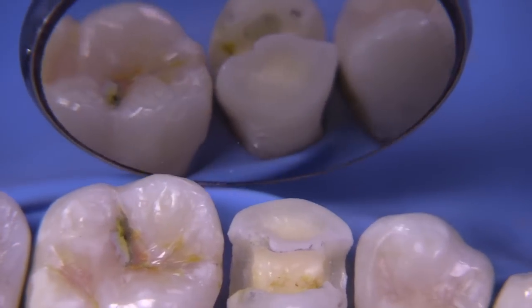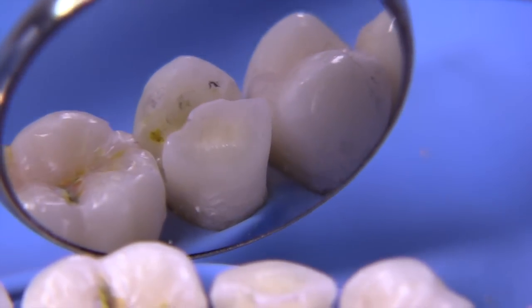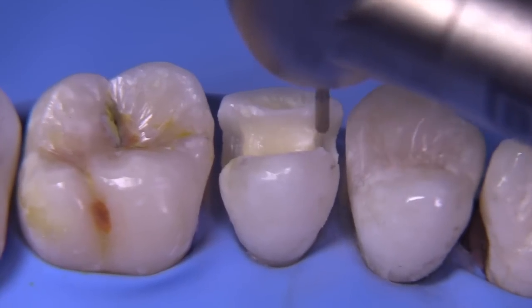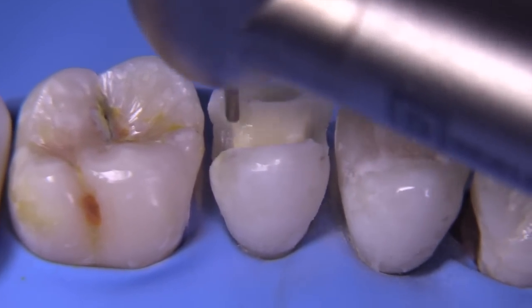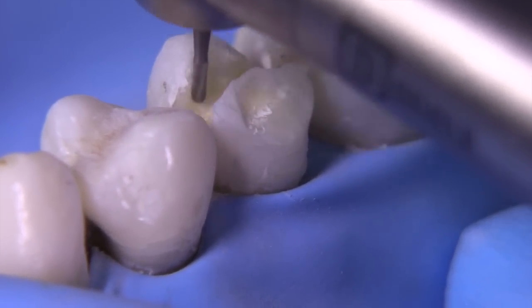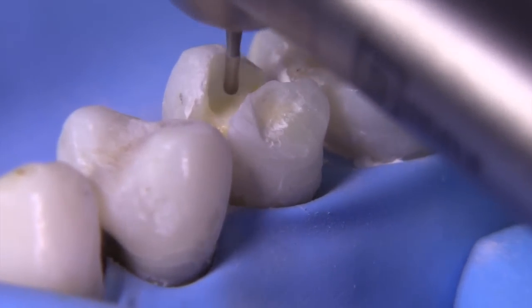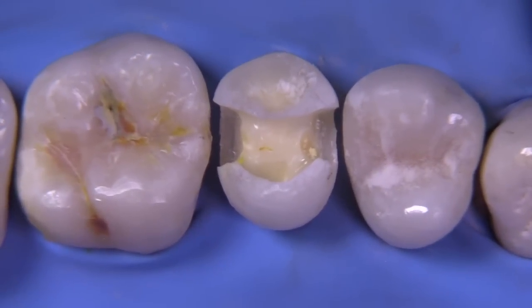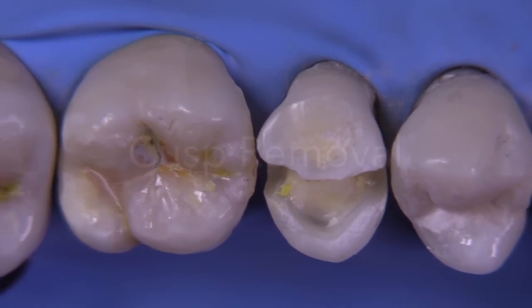Once all of that decay is removed from underneath that cusp, we now need to expand the outline and remove the cusp. I'm going to utilize the 245 carbide because it's longer than the 330 and those cusp walls are pretty tall. We're going to make sure we have a nice clean, rounded internal form and that the DEJ is squeaky clean. We extend the outline form wider and wider until we know that the enamel is resting on dentin. The outline form is going to get quite wide, and now we have to think structurally about what's going to keep that cusp from fracturing — and this is where we remove those cusps.